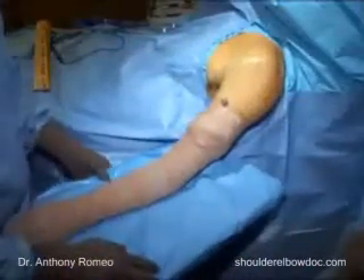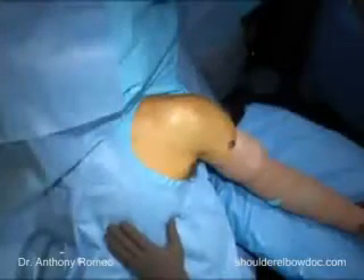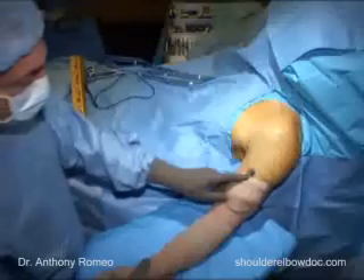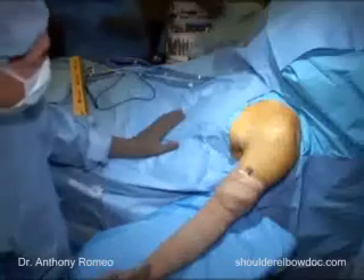We've called a surgical timeout, which is done in all of our cases to confirm that this is the correct side, that the patient is positioned properly, our implants are available, and that they've received antibiotics before we start the procedure. We have also marked the skin at our site, which has been an initiative started by the American Academy of Orthopedic Surgery to help ensure there is no incidence of wrong-site surgery in our operating room.